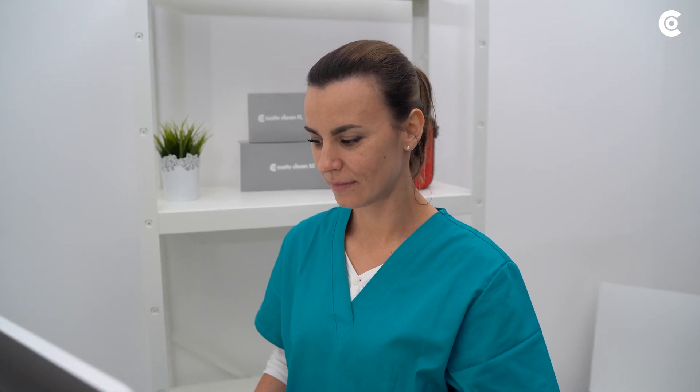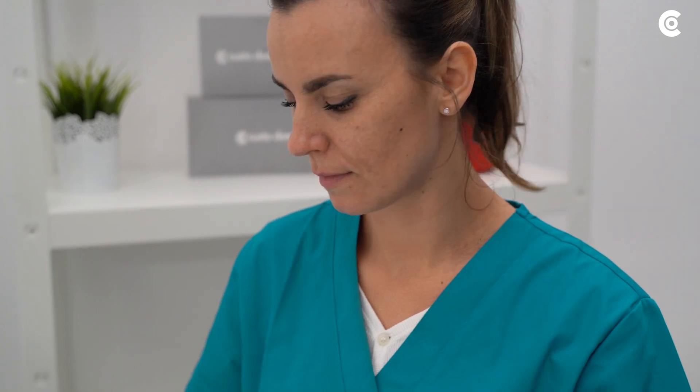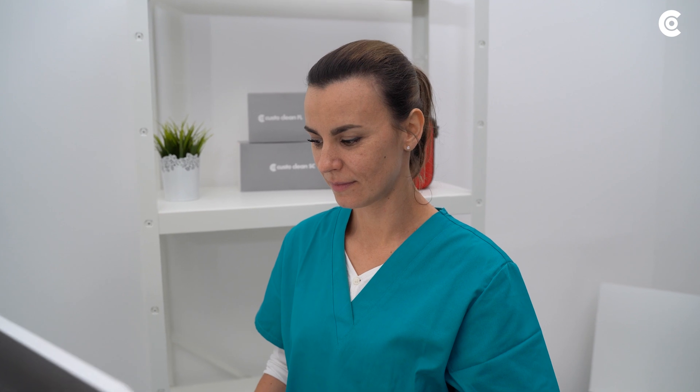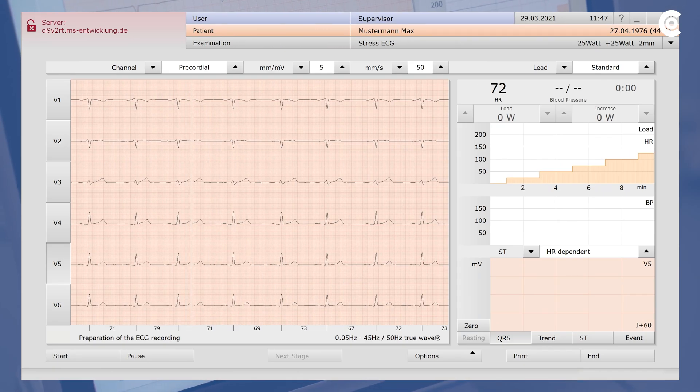Now select a protocol for the measurement and define the desired settings for resting, warming up, stress and recovery phase. Before starting, check the ECG via the software and correct the electrode position if necessary.